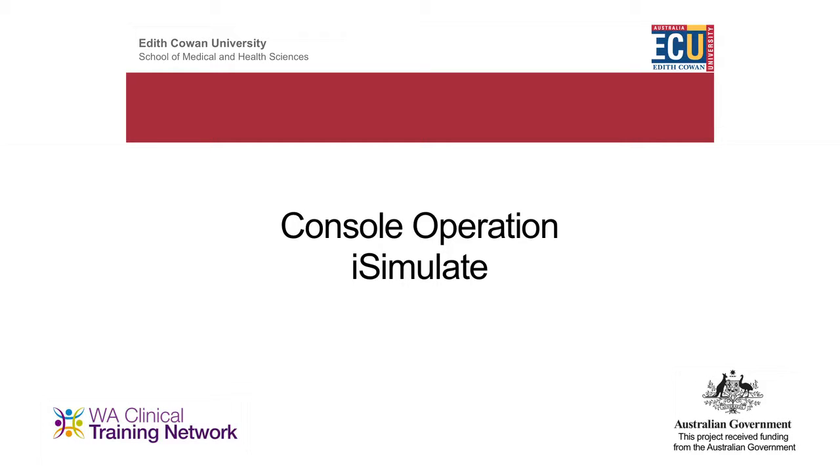This is the iSimulate. It's a simulated monitor with lots of different functions and lots of different screens. It comes with a facilitator pad.